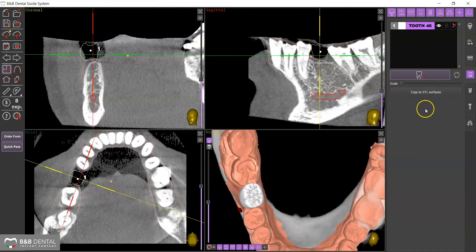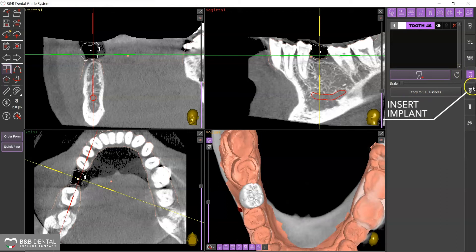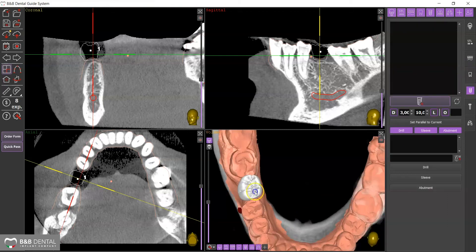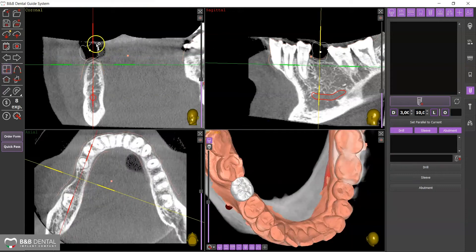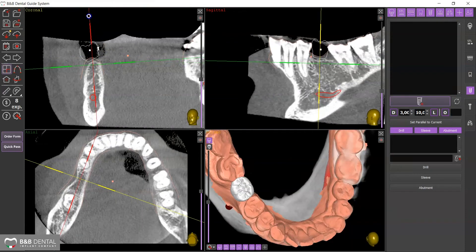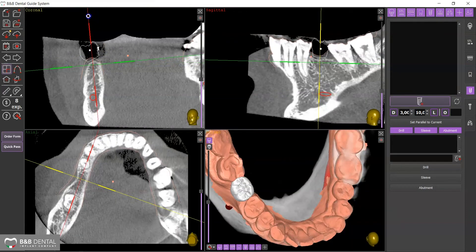To proceed with the planning of an implant, select the Insert Implant tab on the right. Position the axes in the correct direction.